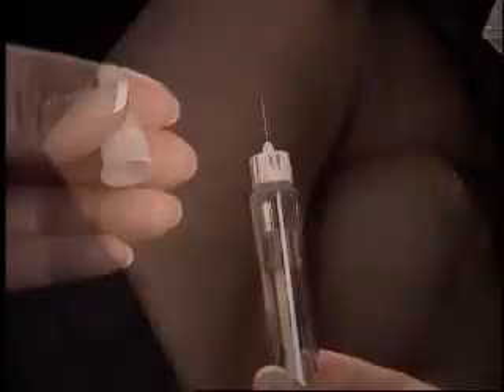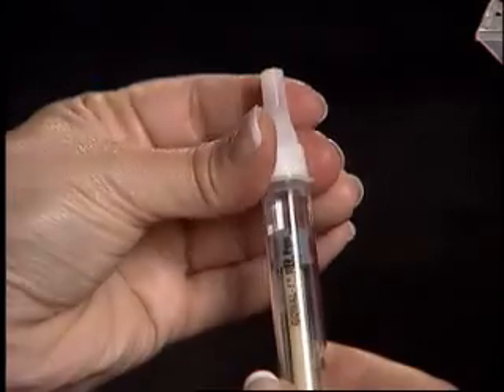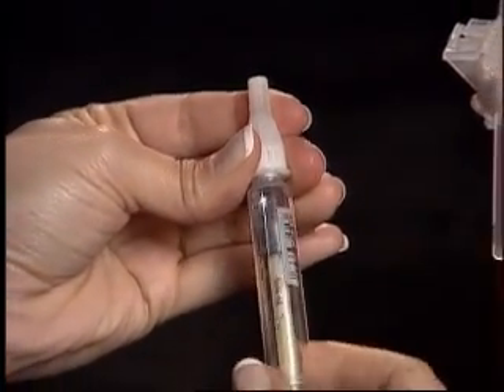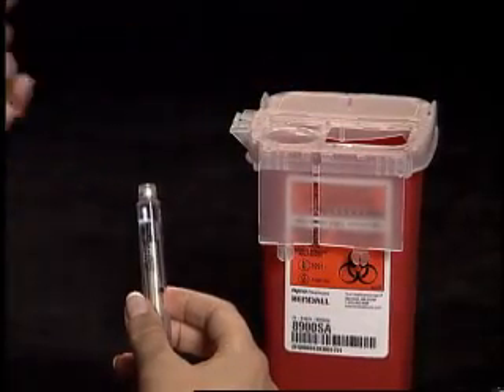If bleeding, wipe with a sterile gauze pad. Carefully replace the outer needle cap onto the used needle and twist off. Place your used needle into the sharps container.